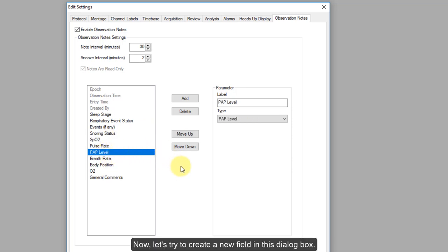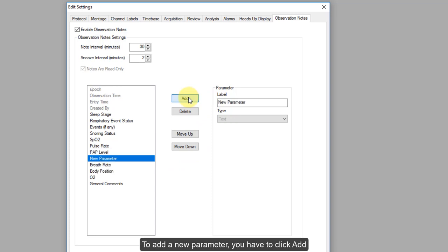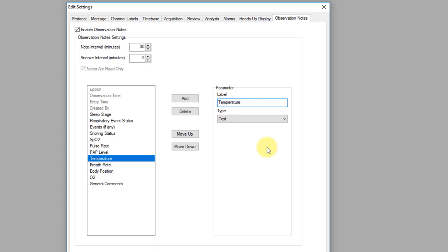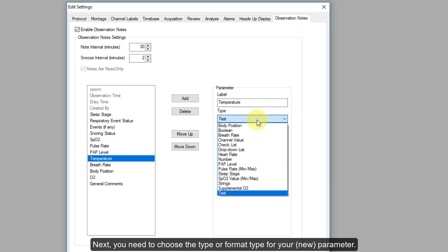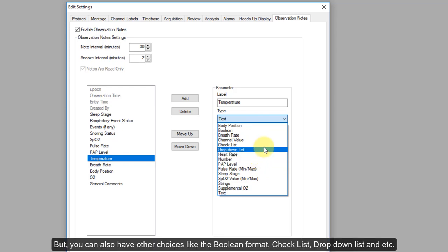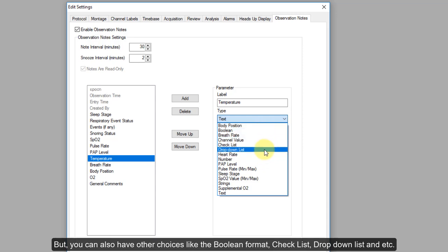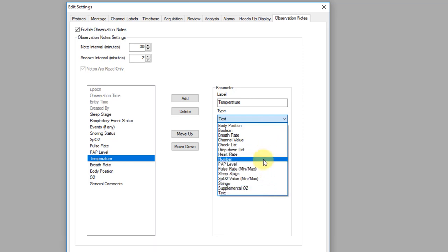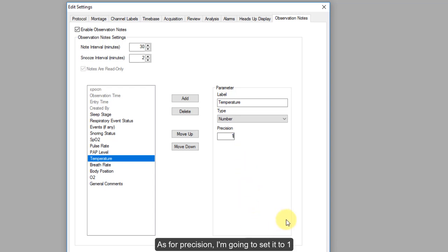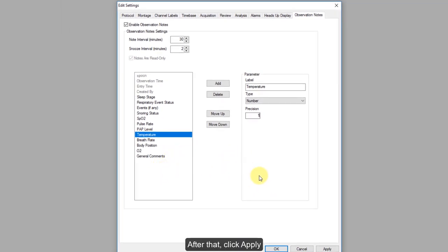Let's try to create a new field in this dialog box. To add a new parameter, click Add, then label your new parameter. In this case, I'm going to add Temperature as a new field. Next, you need to choose the format type for your parameter — I'm going to use Number. You can also choose other formats like Boolean, checklist, drop-down list, and so on. As for position, I'm going to set it to 1. After that, click Apply.